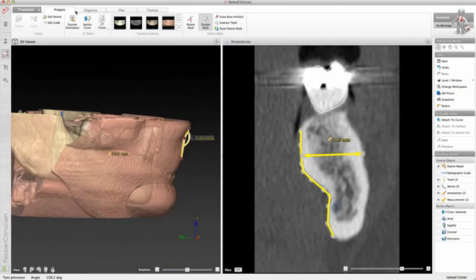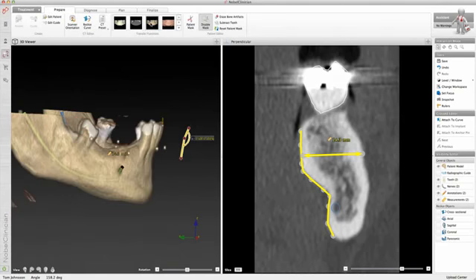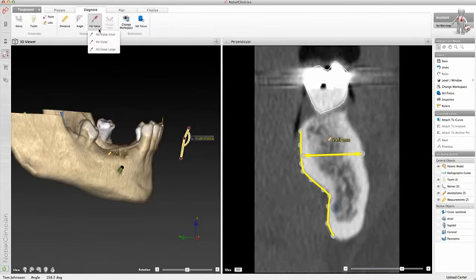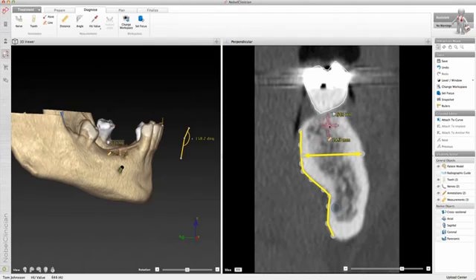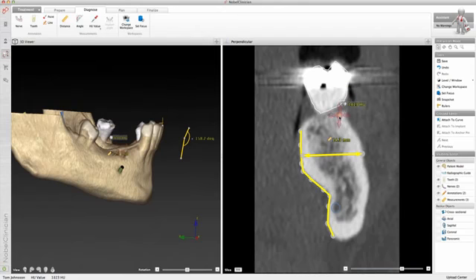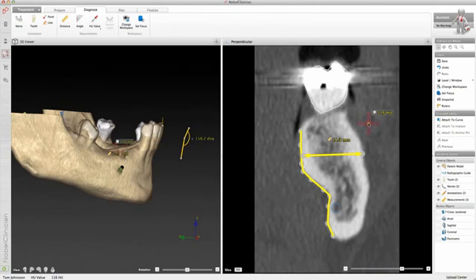Hounsfield unit values can also be measured if a medical CT scanner has been used. Move the point by clicking on it, and the value will update as the point is moved. When using a cone beam CT scanner to obtain the DICOM images, a warning will typically pop up when using this measurement, as the measurement is in grey values and not Hounsfield unit values.